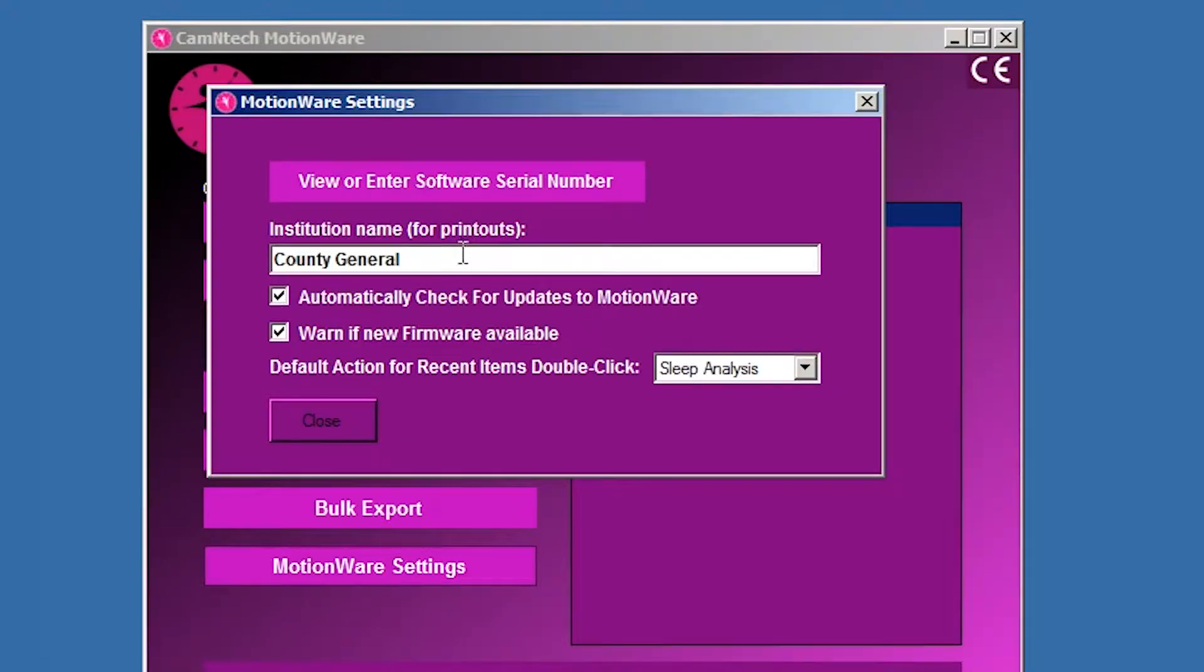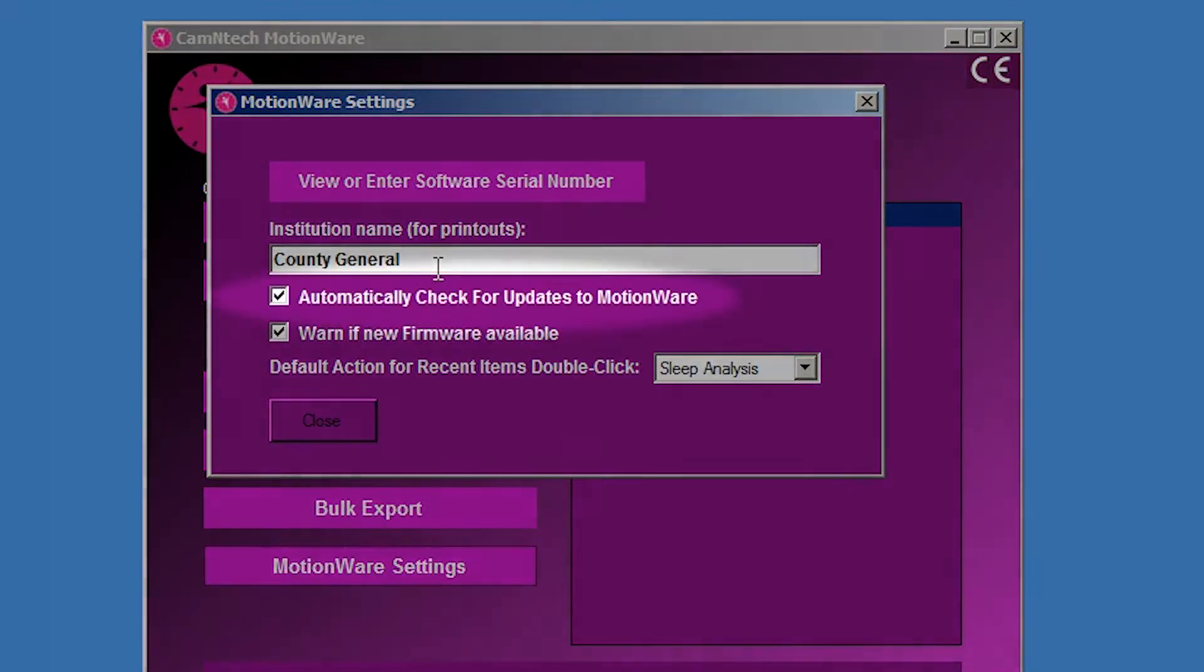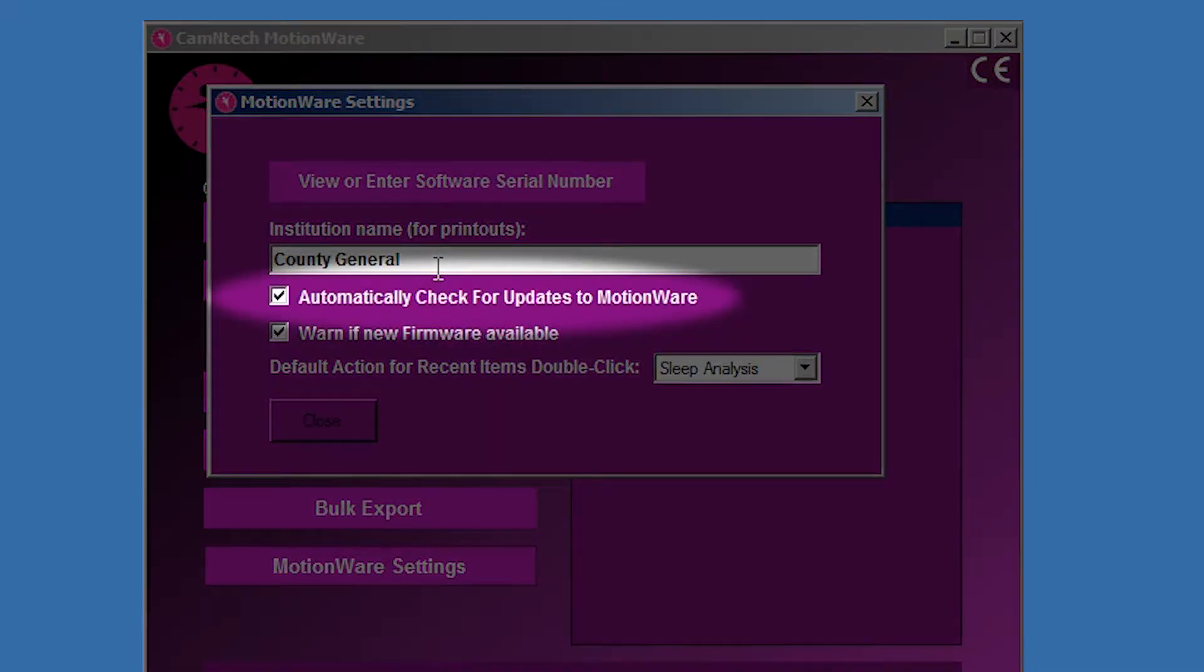The auto check for updates function may be enabled or disabled by checking or unchecking the automatically check for updates selection in the Motionware Settings window. Camentech recommends that you keep these boxes checked.